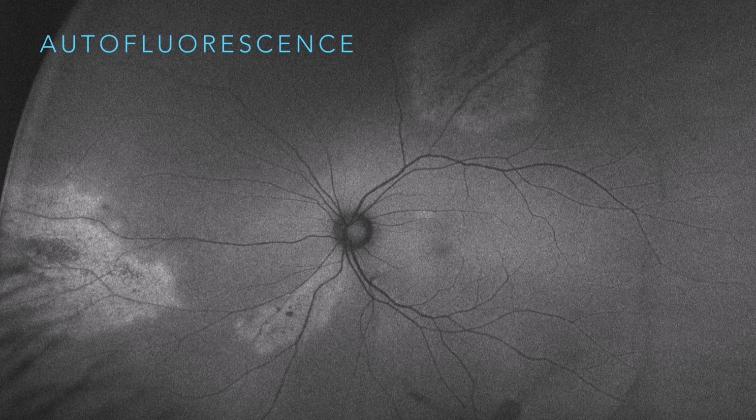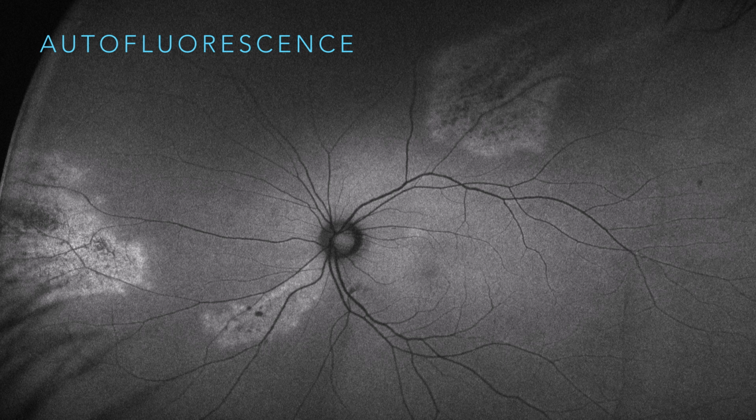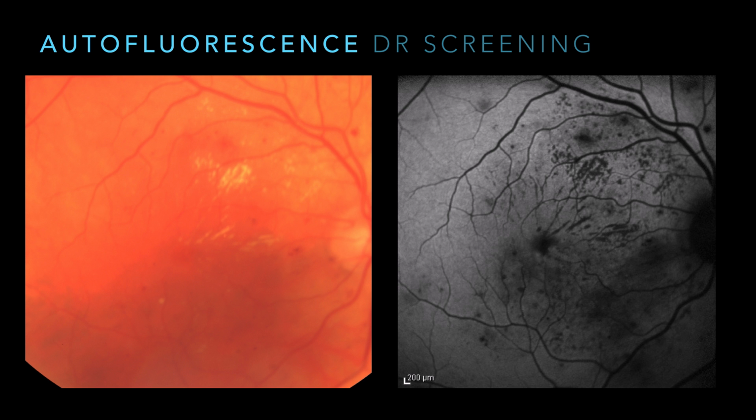This is a patient we weren't sure about the diagnosis initially, did a vitreous biopsy. She had CMV, and I used the autofluorescence to kind of follow her granular CMV. This isn't a reason to actually order autofluorescence right now, but I think in the future with diabetic screening clinics, this takes diabetic screening and dumbs it down.